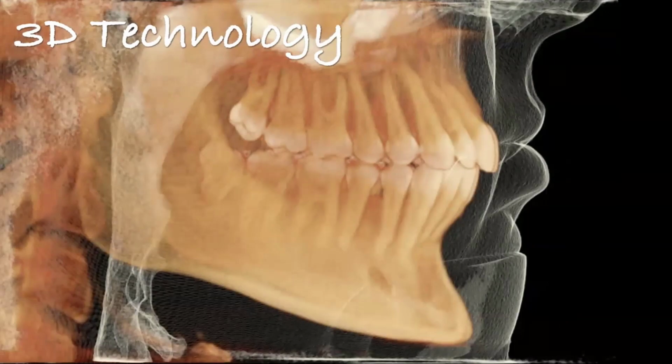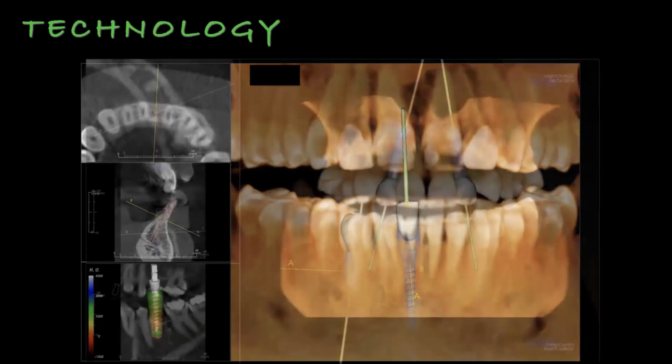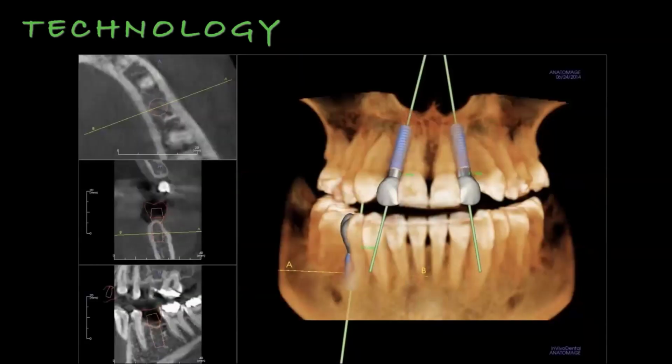We can take 3D technology and we can then sit down and treatment plan a case, whether it's for implants, bone regeneration, extractions, whatever else it is. And we can show the patient and say, listen, this is what needs to be done. You see how thin the bone is? Or we can show them in this case and say, listen, these are the 3 areas where we think you need implants. You can see how the bone dips on the buccal aspect and the cross section over here. And that area needs a graft. And the beauty of this is that this is one scan. It's one software for us to plan the case. We can show it to the patient in the consultation, and plan it with them so they can see what it's like. The communication speaks for itself.